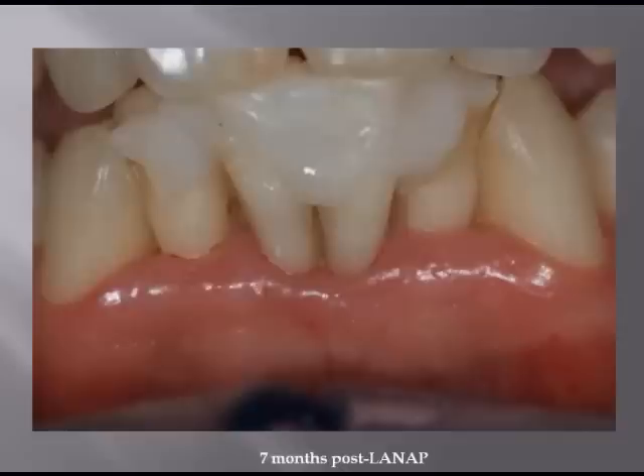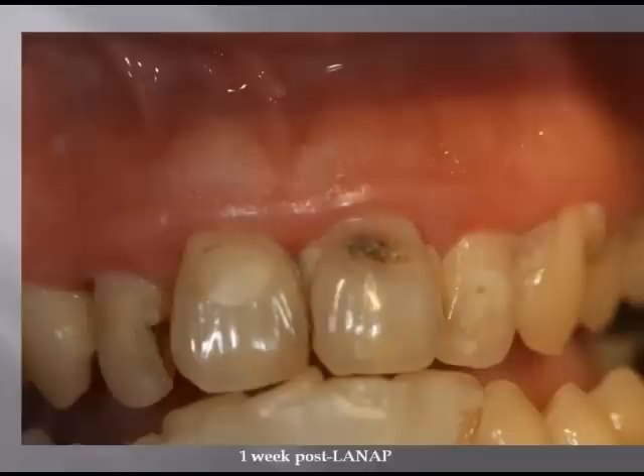Are we going to keep these teeth? I don't know. But if we look now, seven months later, we can see the margin hasn't changed. The tissue's nice and thick. He needs to work on his hygiene a bit, but the teeth are still in his mouth. He hasn't lost the teeth yet. I just know that right now we're going to keep them in place for as long as we can.